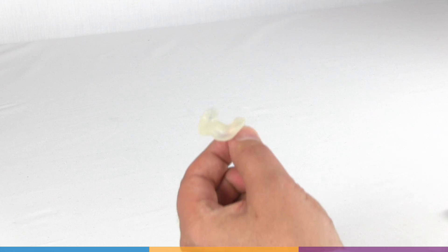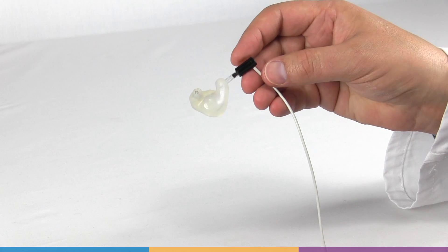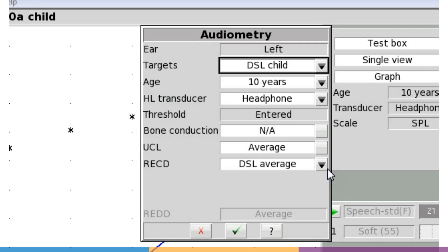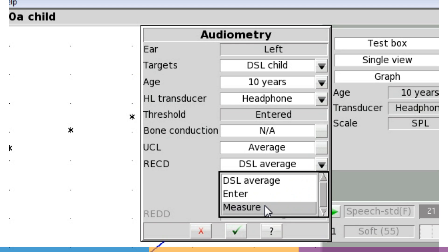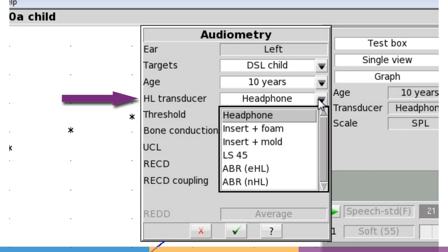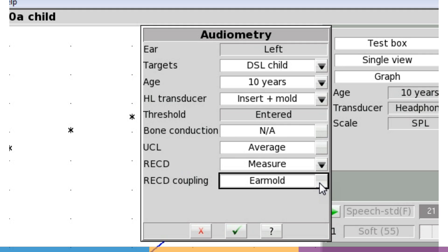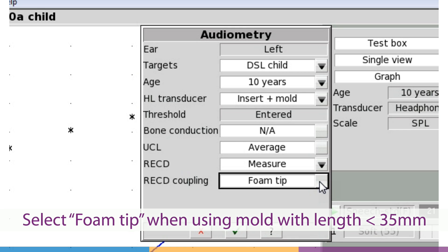The personal ear mold can be substituted for the foam ear tip in the real ear measurement to capture the tubing characteristics in subsequent applications of the measured RECD. Note that in the audiometry entry window, there is a selection for the transducer used in the HL measurement and a separate one for the coupling type used in the RECD measurement. It is important to specify when using an ear mold for RECD. However, for ear molds where the total tubing length is less than 35 mm, we recommend you select foam ear tip so a more appropriate correction is applied.